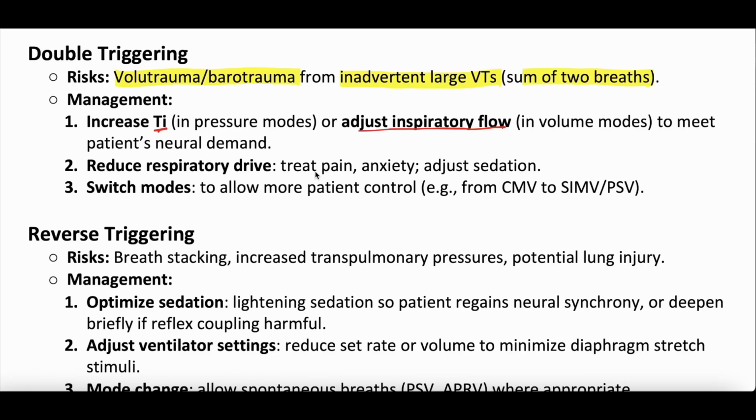You can reduce the respiratory drive by treating pain, anxiety, and adjusting sedation. You don't want to start by making a patient deeply sedated. Try these other things first. Adjust the inspiratory time, flow.